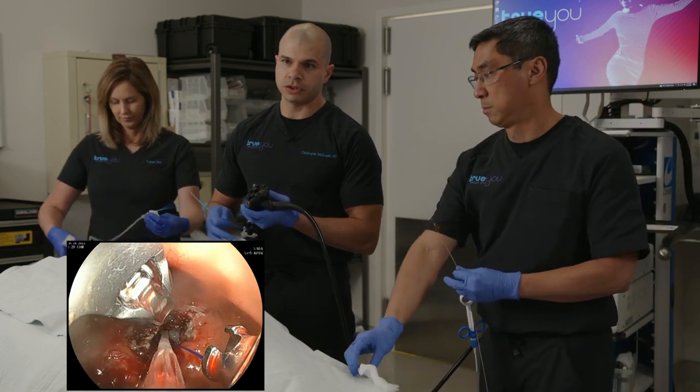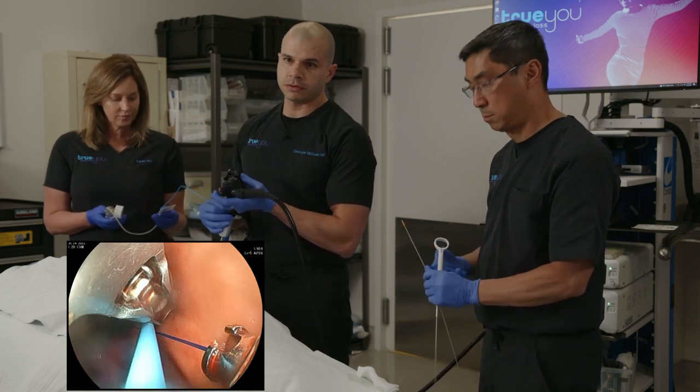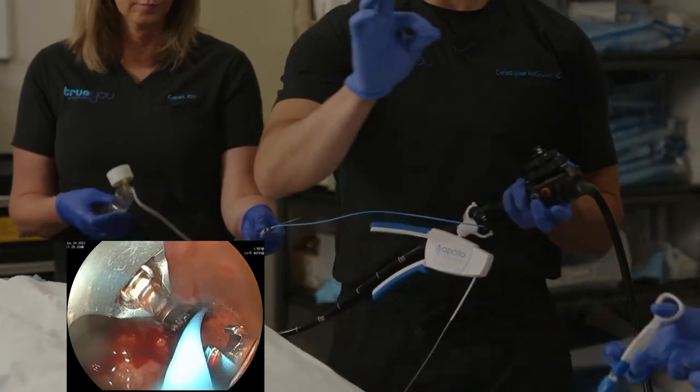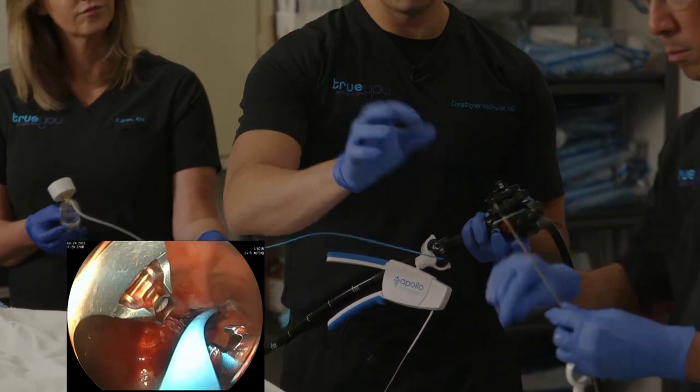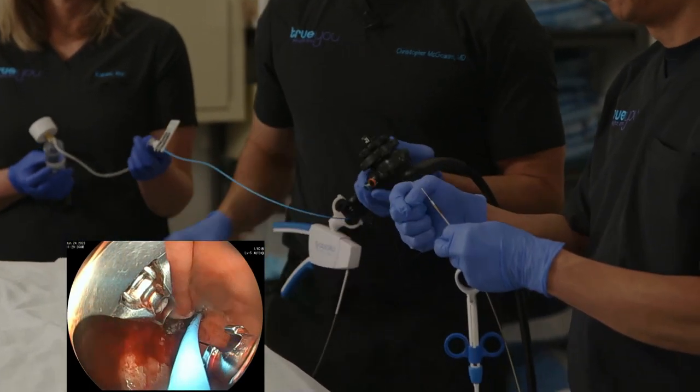I'm going to pass this through following the roux limb, so up and to the right is where that was located. And then we're going to load a cinching device. So this cinch will tighten that suture and lock and cut it. And then this suture will stay in place.